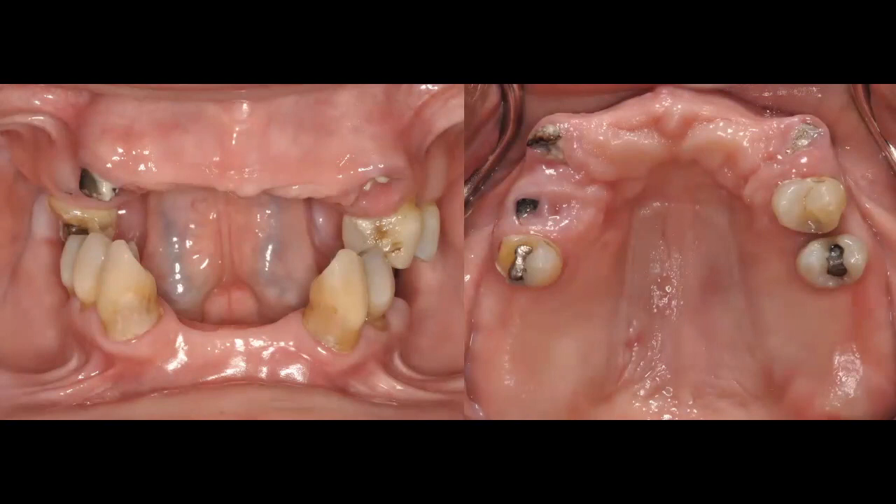Sometimes a patient presents and we know we're going to be doing extractions. In this particular case, we're going to extract the remaining maxillary teeth and deliver a complete upper denture. We'll also extract one mandibular tooth. I want you to look at this photo — there is a vertical dimension still present in this patient, and that's an important factor.